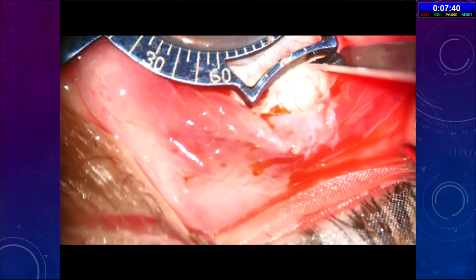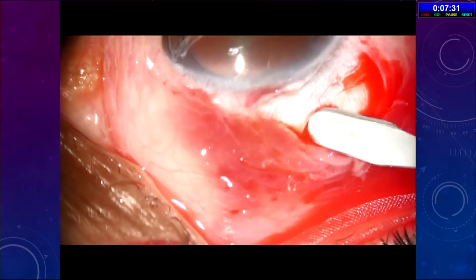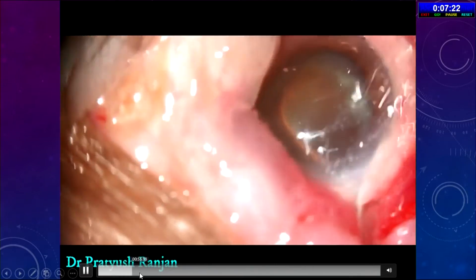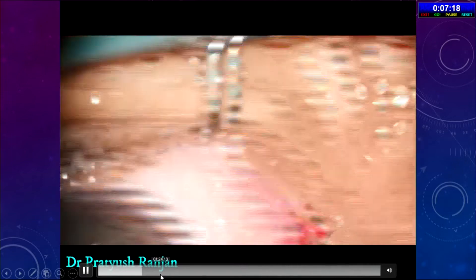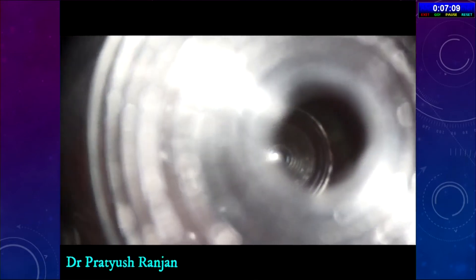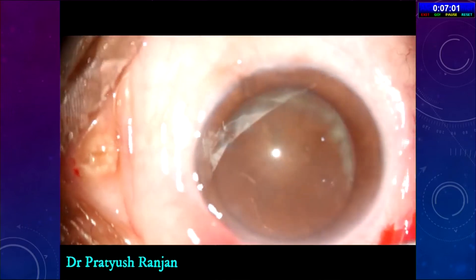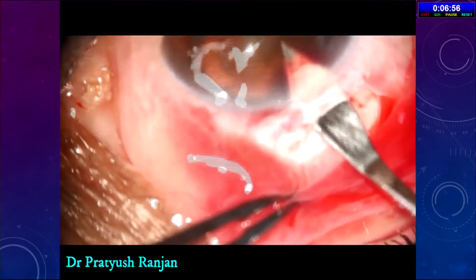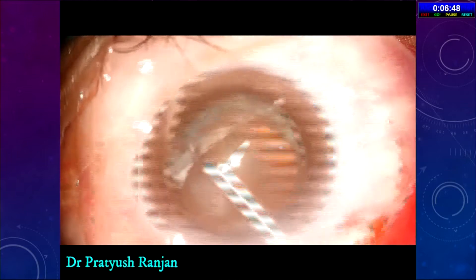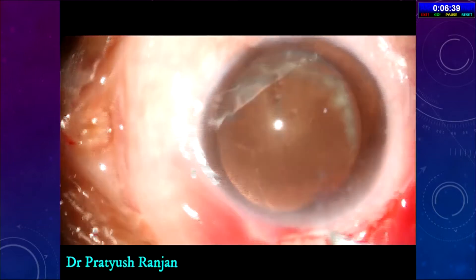Using the Ranjan marker, the incision on the sclera — all of this is absolutely the same as we do for all SICS. The only smart step is the third step where we enter the eye. What we used to do earlier: we would use a keratoscope, which gives inner three rings that we check. If they are perfectly circular, we move ahead and make a small entry in the middle, then go with a curved cannula and stretch the cornea horizontally. We then check again with the keratoscope whether the mires are now circular, and then move ahead.